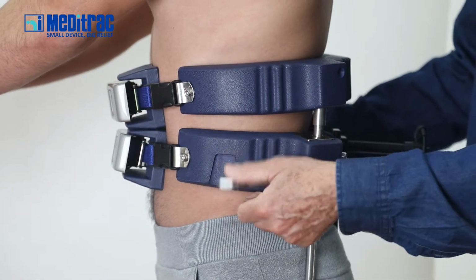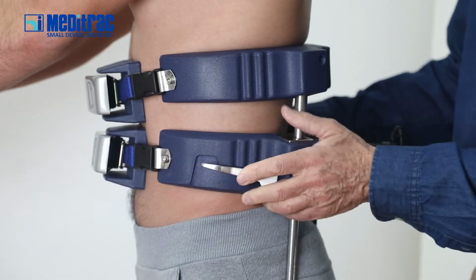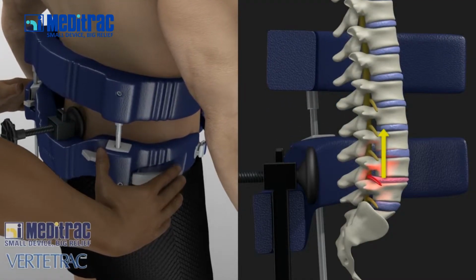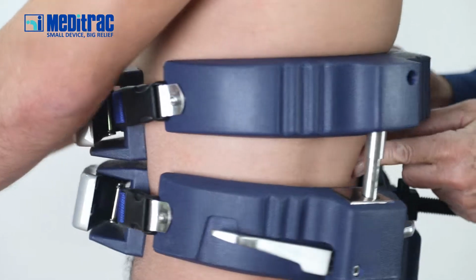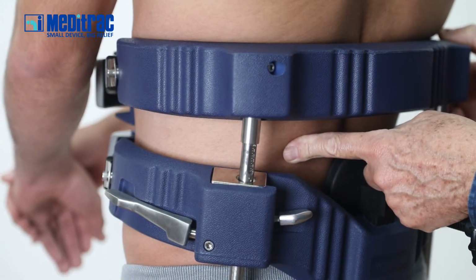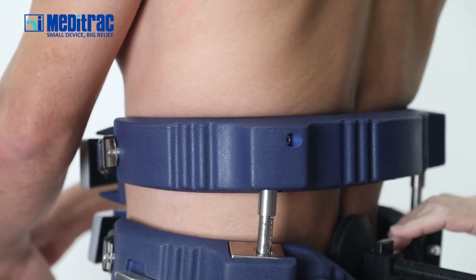Apply lumbar traction by simultaneously jacking both traction levers at a consistent rate until the skin is tightly stretched between the upper and lower frames and there is considerable resistance to the movements of the handles. The skin below the upper frame should be taut so that it cannot be caught between the fingers. The skin above the upper frame should be folded.